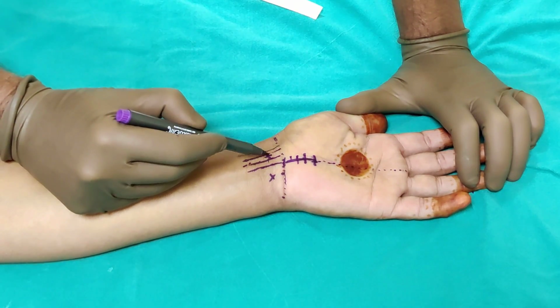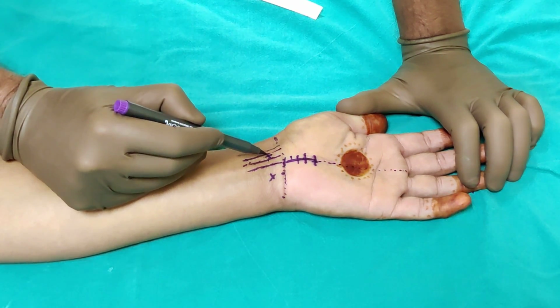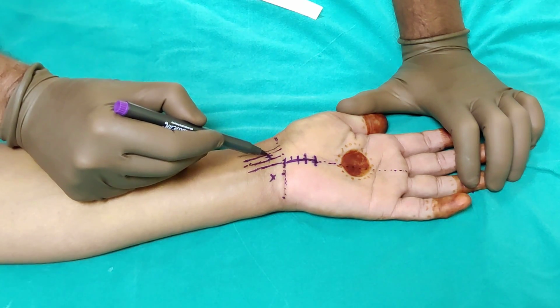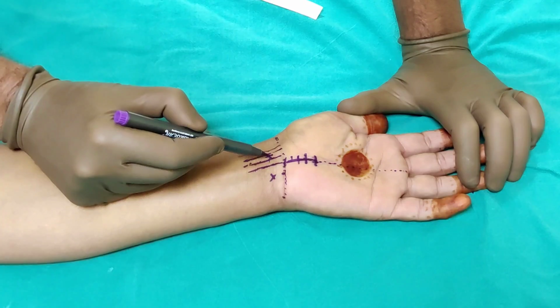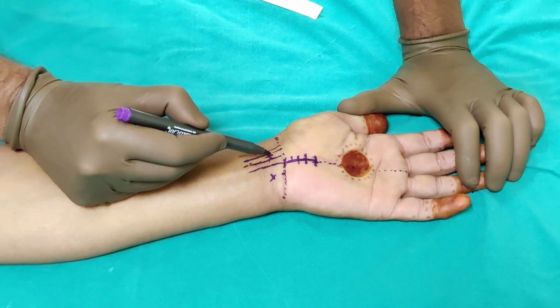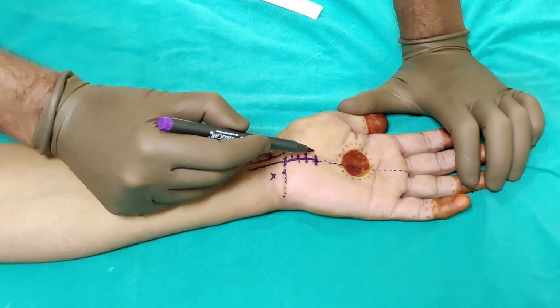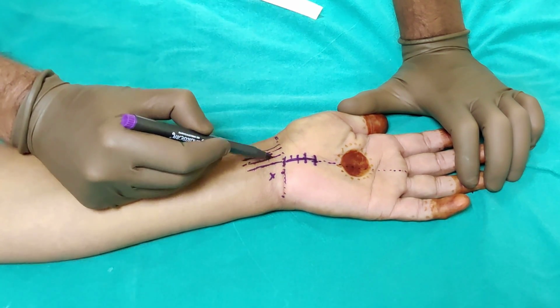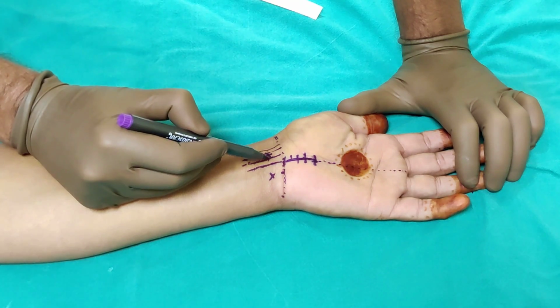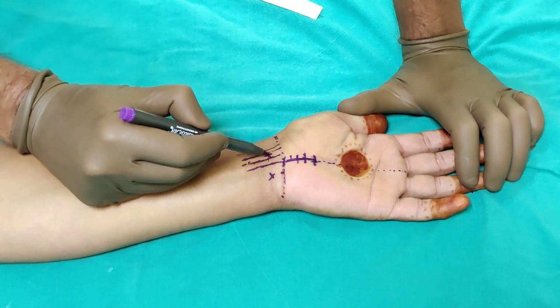And the reason I use the radial approach is because you have to angle your needle at roughly somewhere between 20 to 40 degrees. I keep it around 30 degrees. So if you angle it like this, you are away from the median nerve, because the median nerve is slightly more ulnar, and that is the reason I prefer to go in between the tendons, and I will be 1 centimeter proximal.